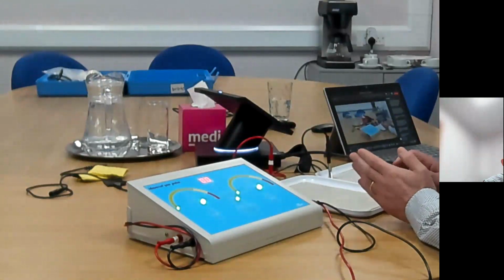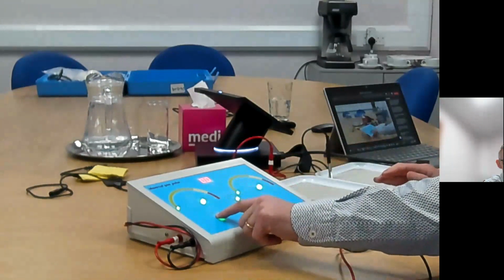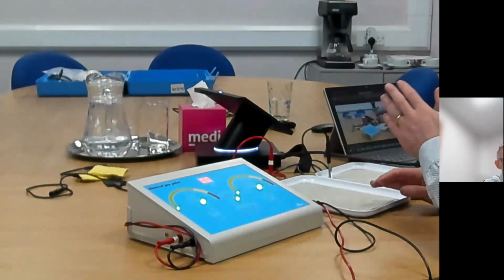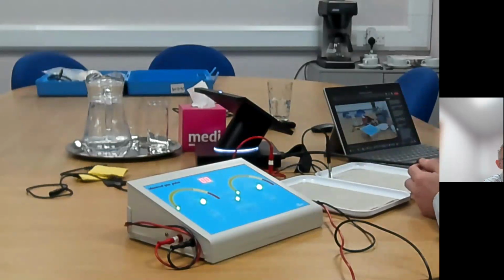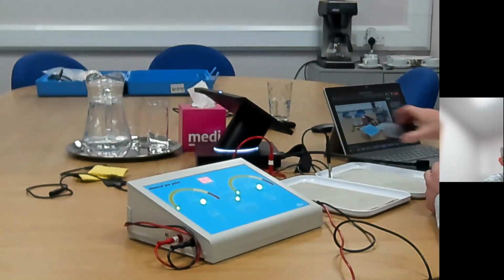and treat for a further 10 minutes. After a further 10 minutes, stop the hand treatment by reducing the current down to 0, but continue the feet current flow for a further 5 minutes. So that means the patient's had a further 15 minutes on the reversed polarity of treatment and 30 minutes of treatment for their feet in total, 20 minutes for their hands. That then should ensure that both sites get effectively treated.